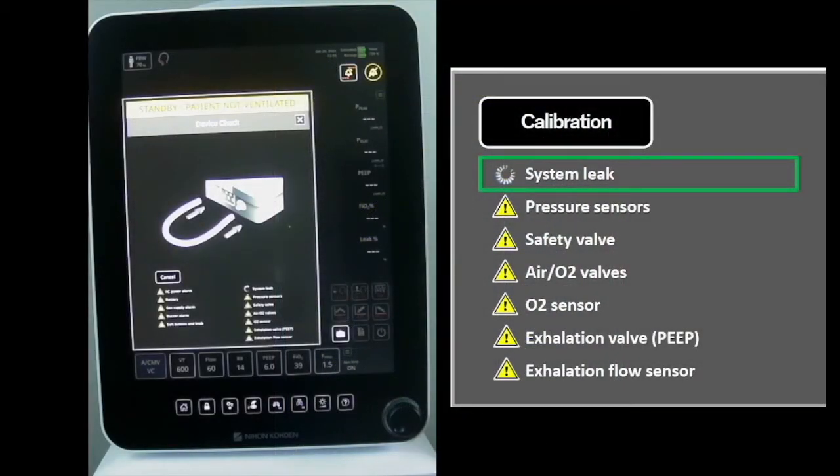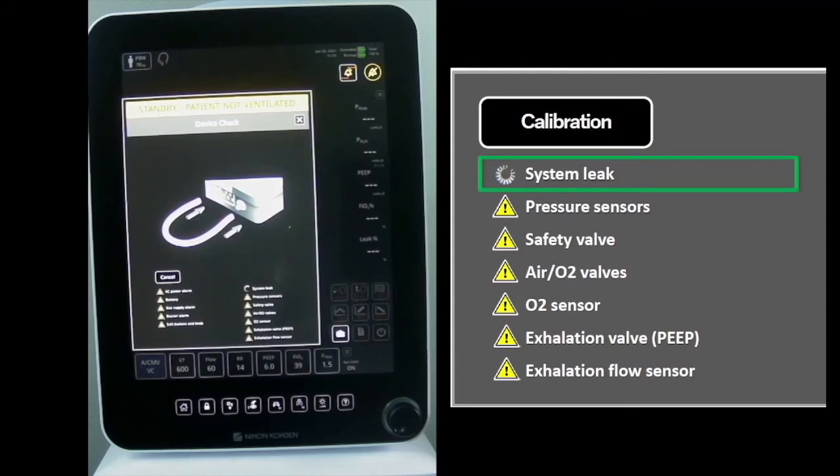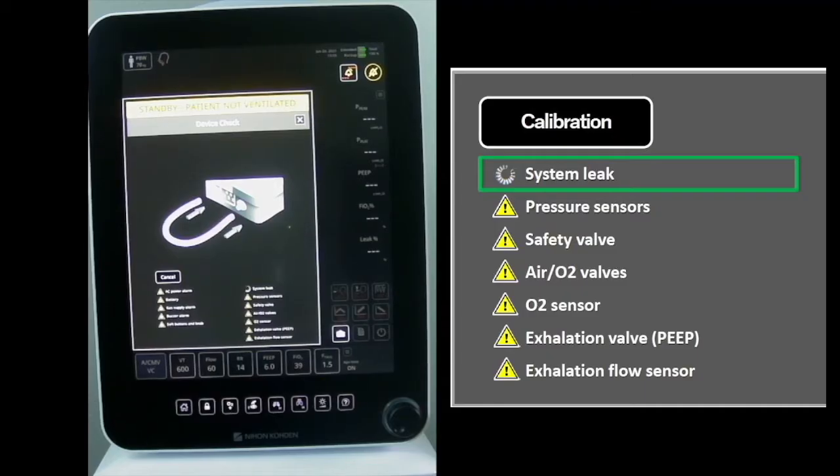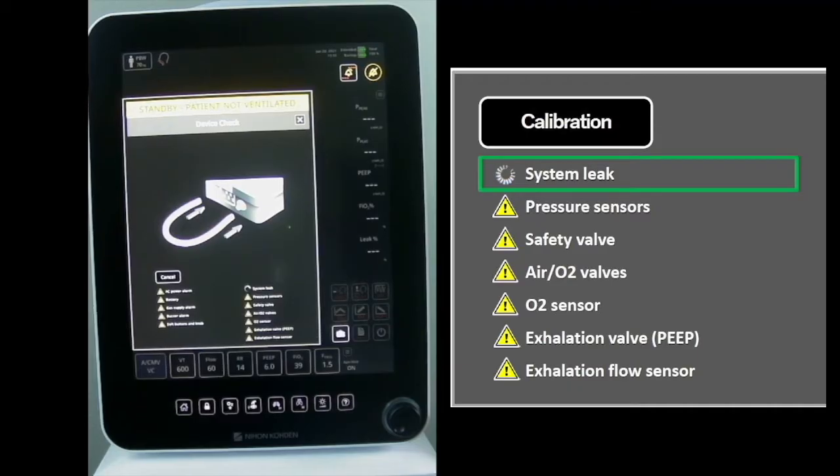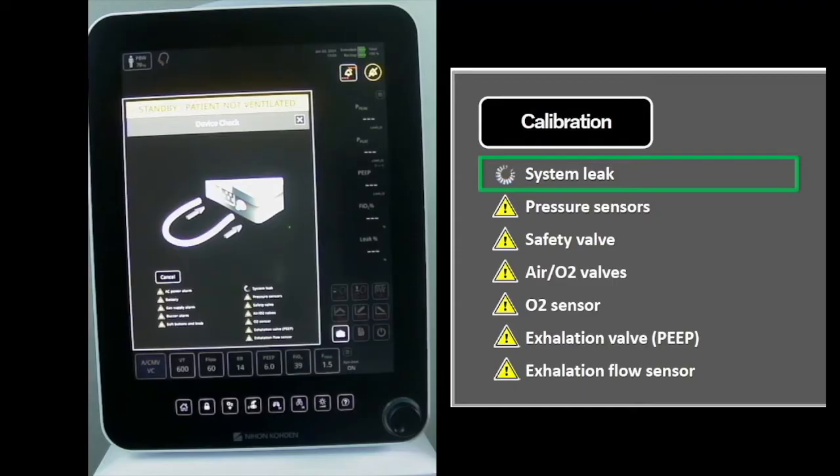The system leak test is comprised of two stages. The first stage checks the resistance and compliance of the testing tube. In the second stage, the testing tube is pressurized to 60 centimeters of water, then the system leak is assessed by the internal airflow sensor and the P1 and P2 pressure transducers.